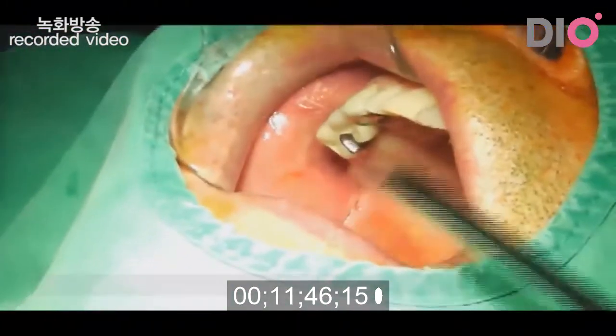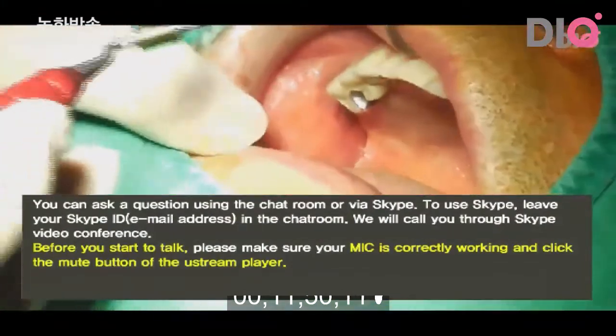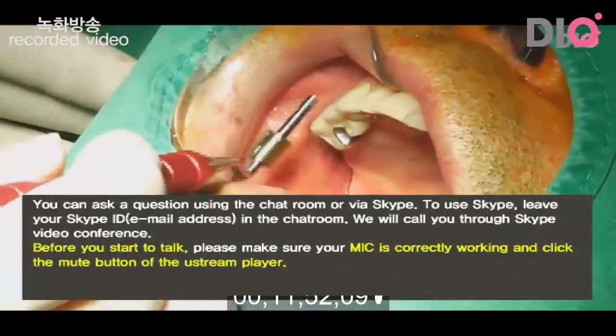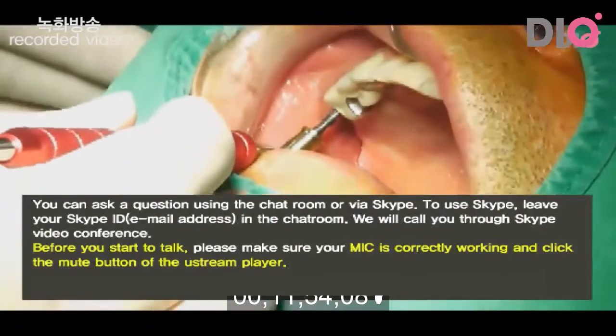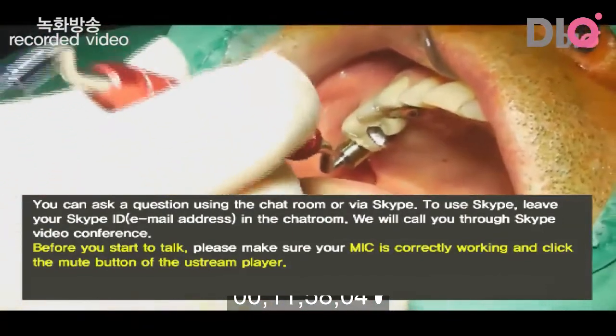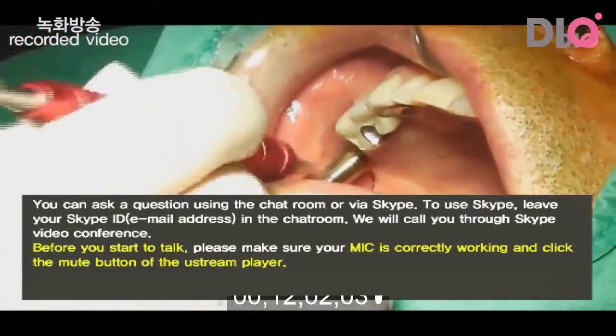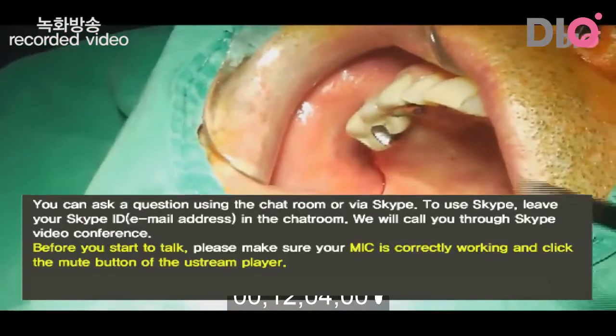Then I will check. I confirm whether the opening site in the sinus floor is clear. Okay, it's clear. And then the second side is 1 millimeter deep, ready?